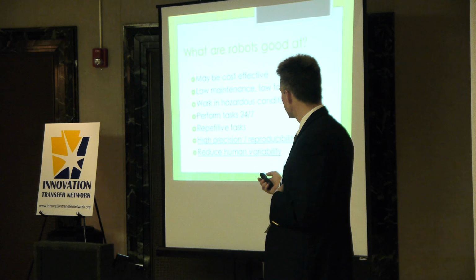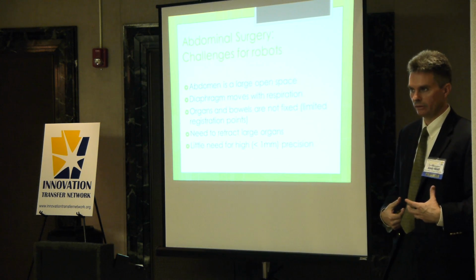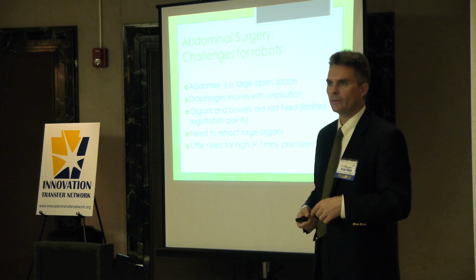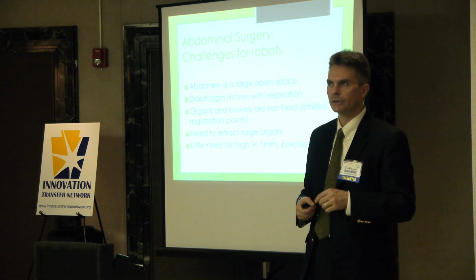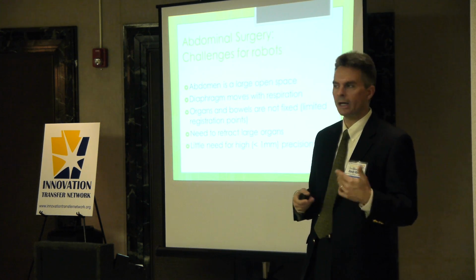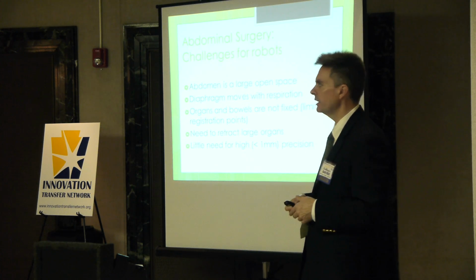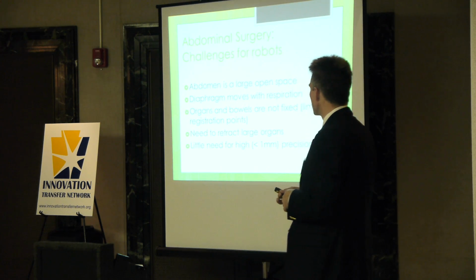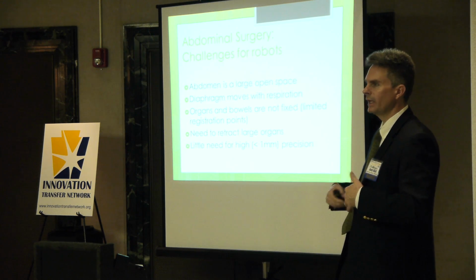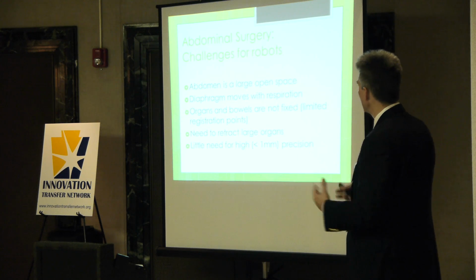And so this is some of the areas that we've worked on. I do abdominal surgery for a living. When you see the Da Vinci on the billboard, that was developed primarily to do surgery in the abdominal cavity and the thoracic cavity. You probably know there are robots that do orthopedic surgery. There are Gamma knives, which are essentially robots. Very, very different. So as we develop these things, how can we reproduce the day-to-day operations we do? Gallbladders, hernias, lung cases, in these large spaces.